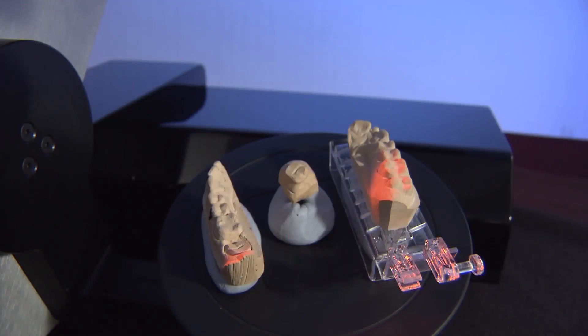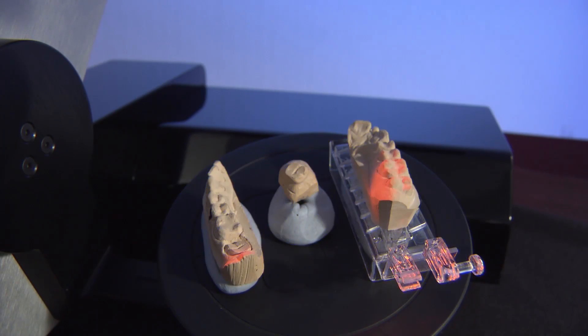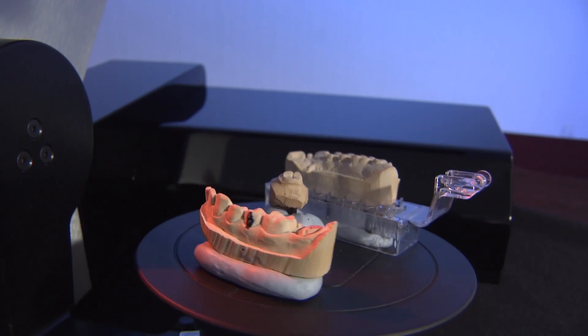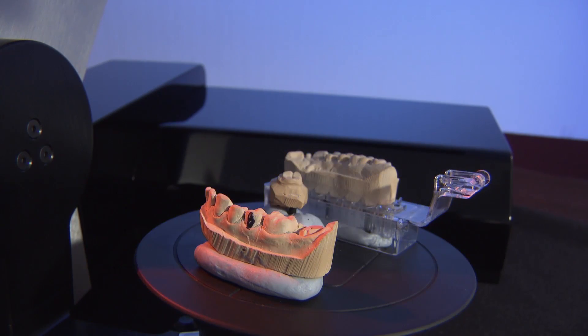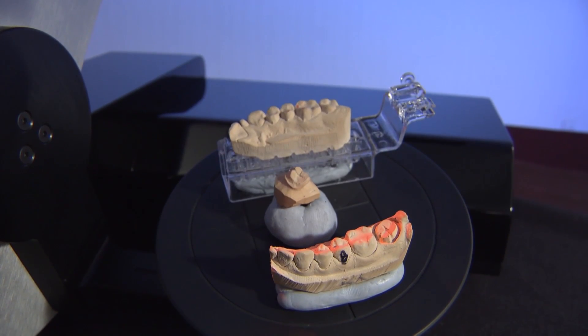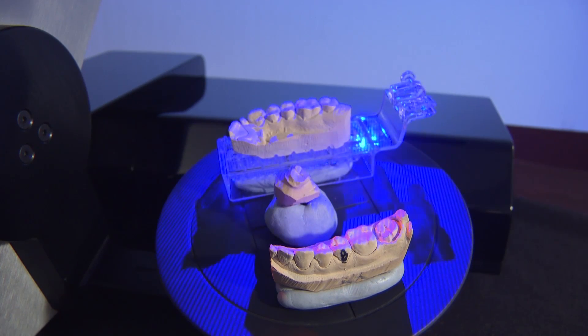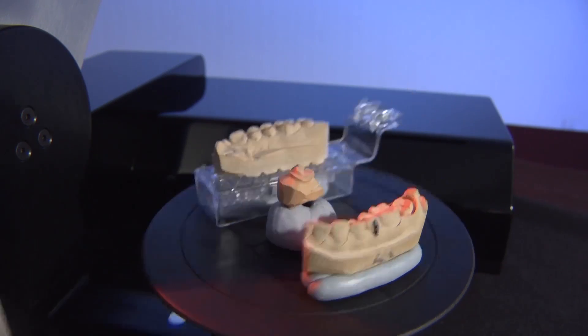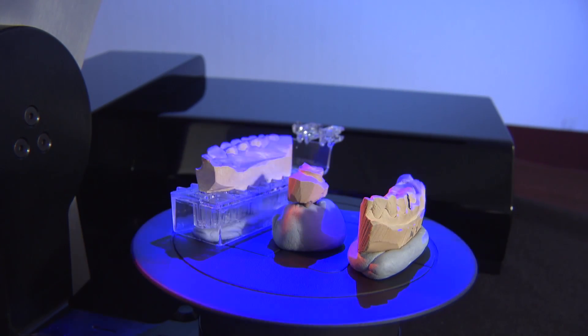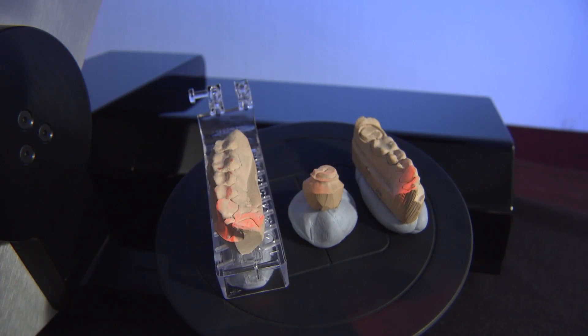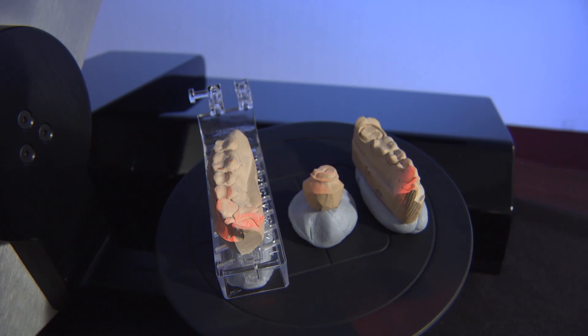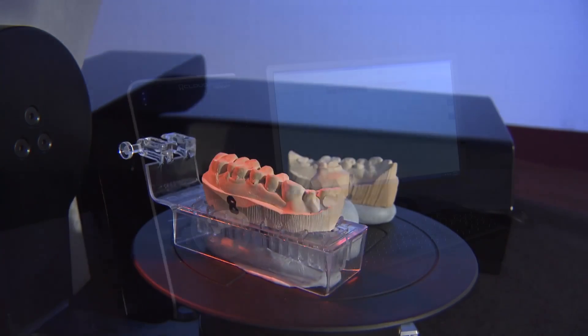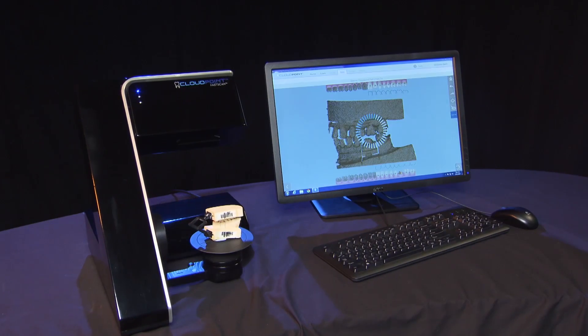Most dentists today still aren't taking digital impressions. It's only about 12% of the impressions we receive. On the rest of them they're polyvinyl and polyether, and as a result we still have to pour it up into a stone model and then we scan the stone models to get it into the digital environment. That's why when a dentist actually scans the patient's mouth and sends us a digital impression, we don't have to do any of this stuff I'm going to show you.